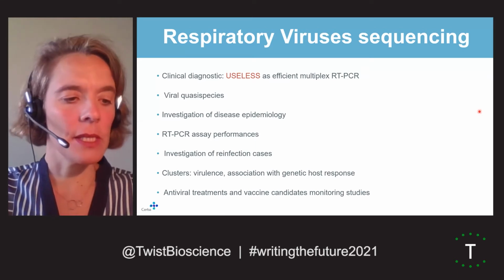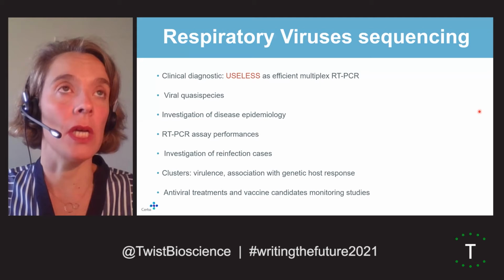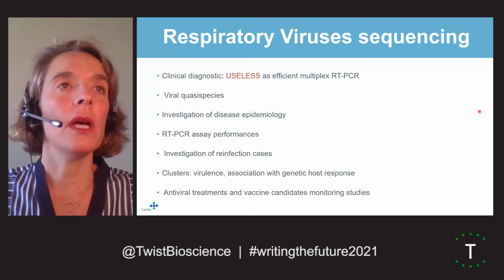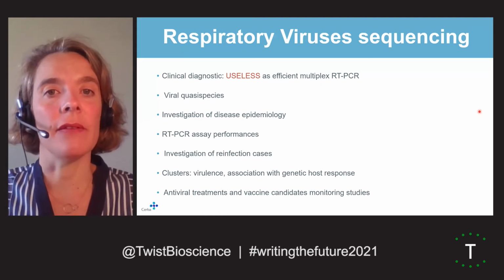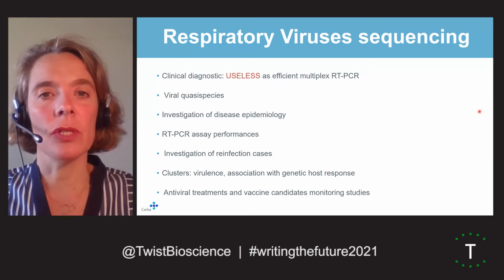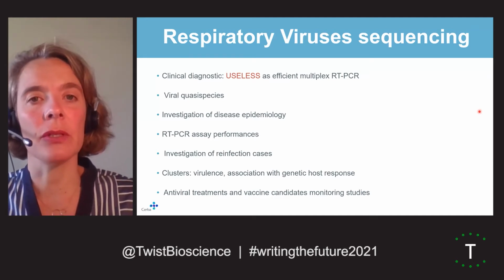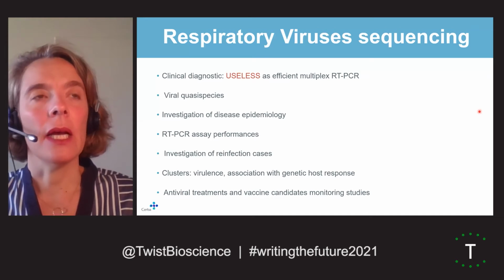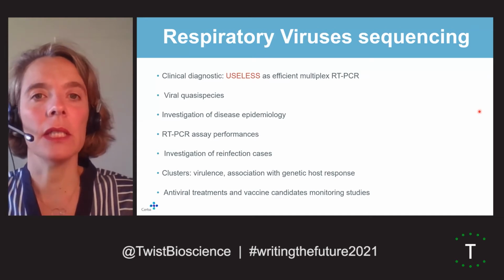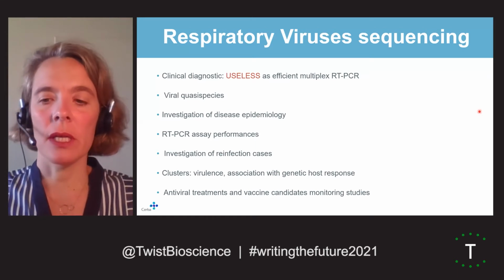In practice, over the course of this pandemic, SARS-CoV-2 sequencing is useful to investigate viral escape, the disease epidemiology, to investigate clusters or reinfection cases, and to check RT-PCR assay performances, as we will see later in this presentation.